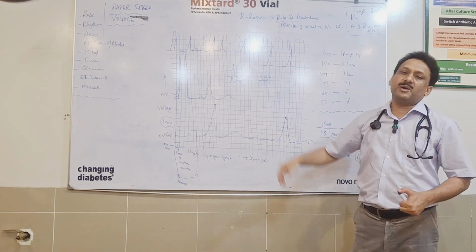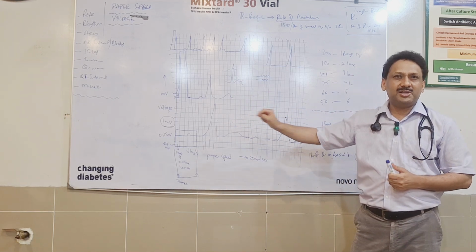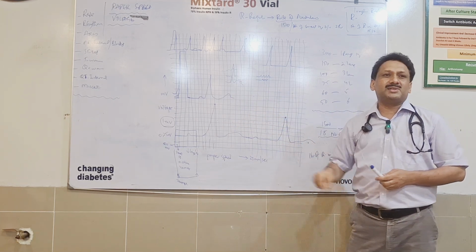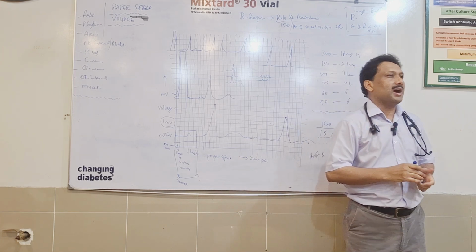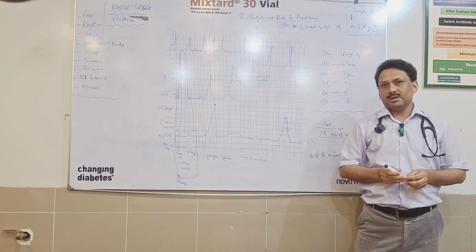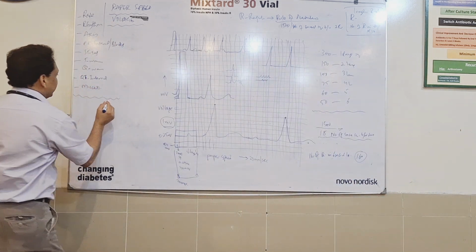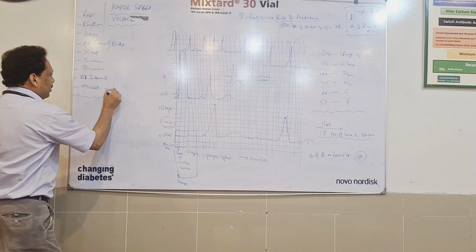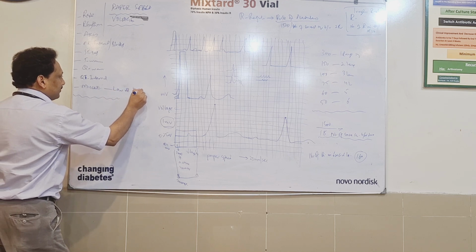As we are focused on this voltage thing, at exactly the same point, I would like to guide you about the low voltage and high voltage ECG. This is part of the miscellaneous. I haven't mentioned it here. So, low voltage and high voltage ECG.